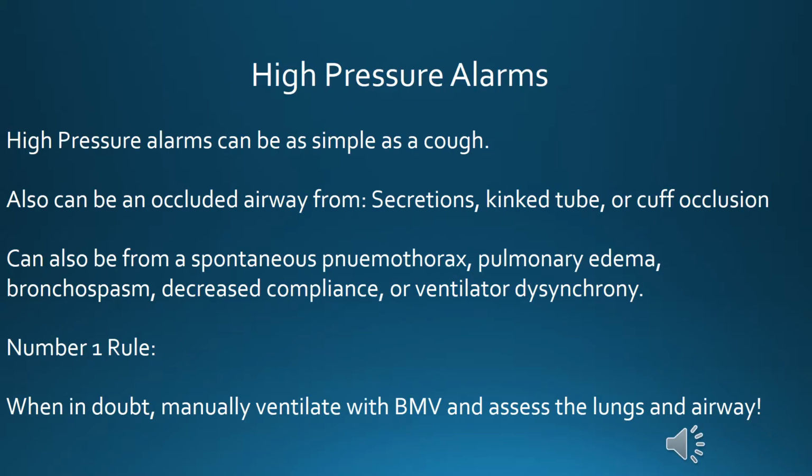Let's talk about ventilator alarms. High pressure alarms. That's probably the most common alarm us clinicians often hear, the high pressure beeping with each breath. High pressure alarms can be as simple as a cough. In a good strong patient with pneumonia, or coughing secretions, you'll often get a high pressure alarm associated with a cough. However, everything is not as simple as a cough.